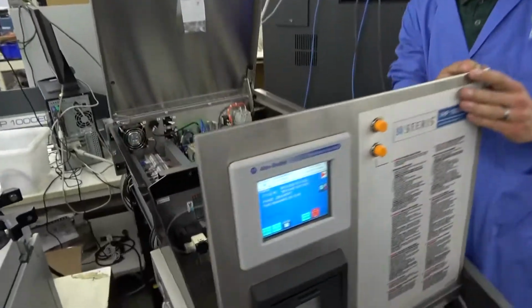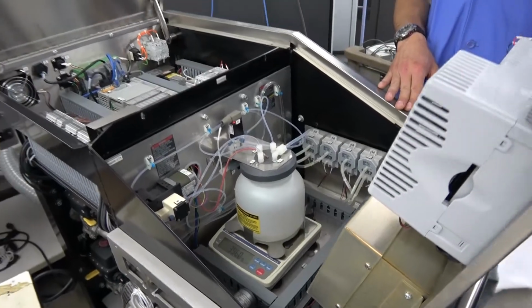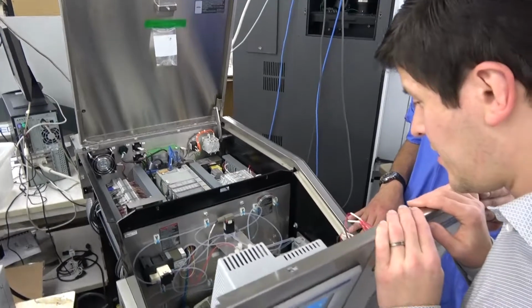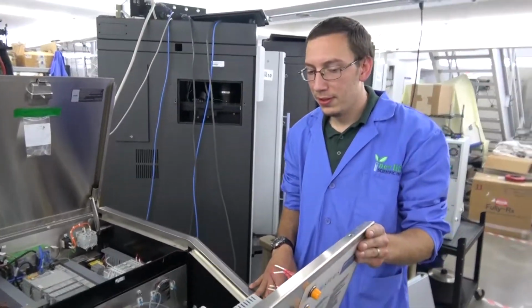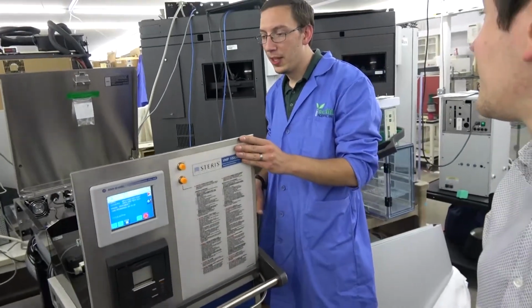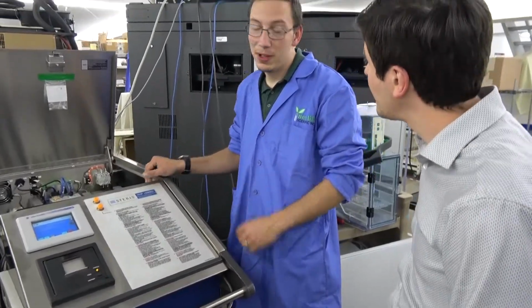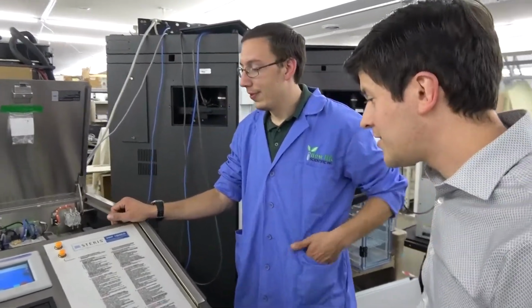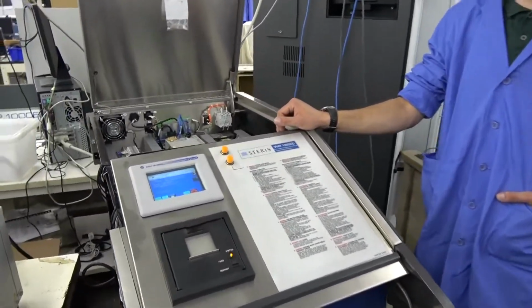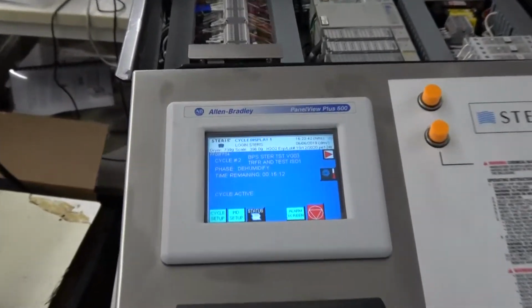Yeah. So this is a vapor hydrogen peroxide decontamination system. This is the current model, right? No, it's a step before current, actually. Okay, so it's one generation before the current Steris model, but boy, the controls on this are way better than the controls of other systems. If they'd stop changing their systems so much, maybe it would be current. So the difference between this and the current model is probably practically nothing. There was something notable, but I don't remember. You didn't note it? I think they switched away from Allen Bradley.